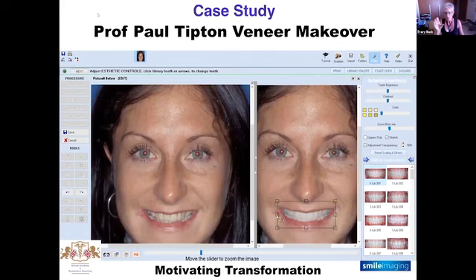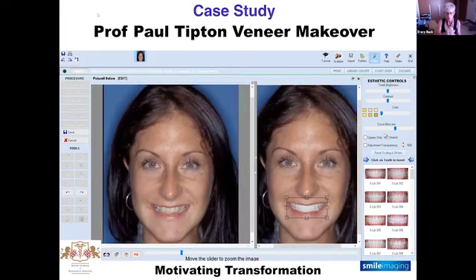And then we can click on the adjust transparency in the stretch box. As you can see now, we're stretching the teeth out. We can see the teeth underneath, so we can make sure this is anatomically correct as a two-dimensional photo can be. And this is to gain the acceptance before we embark on our diagnostic models, okay? We've then got the curved bite line we can adjust, and the colour, contrast and brightness there.